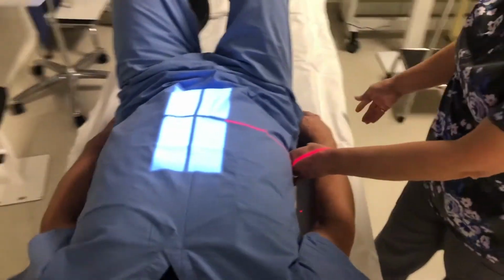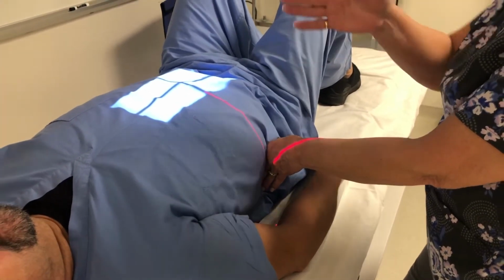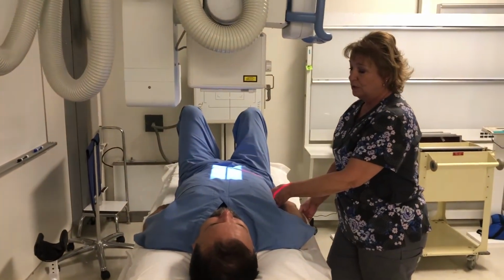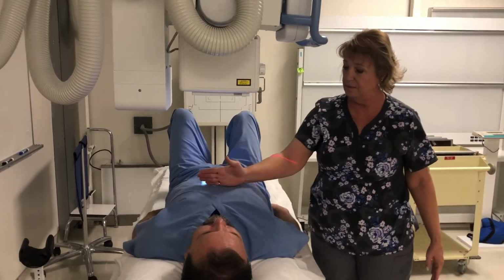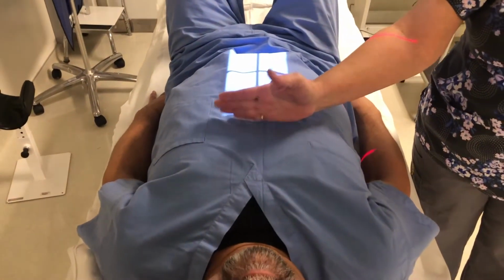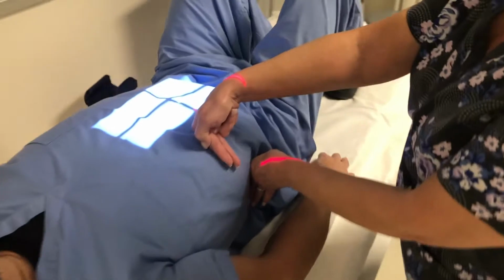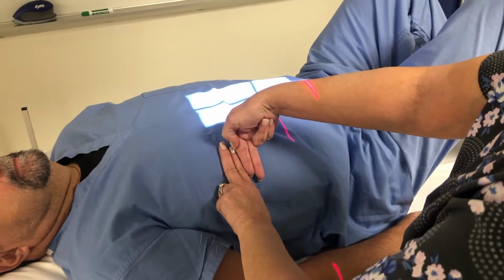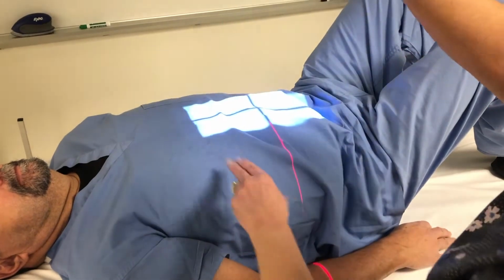Feeling for the top of his crest. Now I'm going to be centered at the crest or 1.5 inches above. And really that depends on the height of your patient. He's of average height, so I would probably center closer to the crest than I would above the crest, because you can see that the top of my light field is well above where his diaphragm would be. So if the crest is L4, 3, 2, 1, I want to include T12, and so I have T12 and L1 easily within the light field, and then down to a good portion of the sacrum.